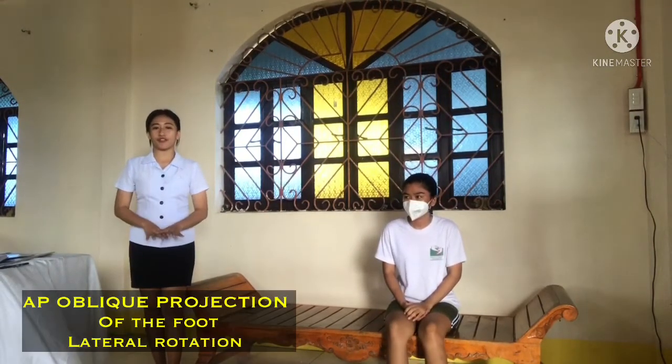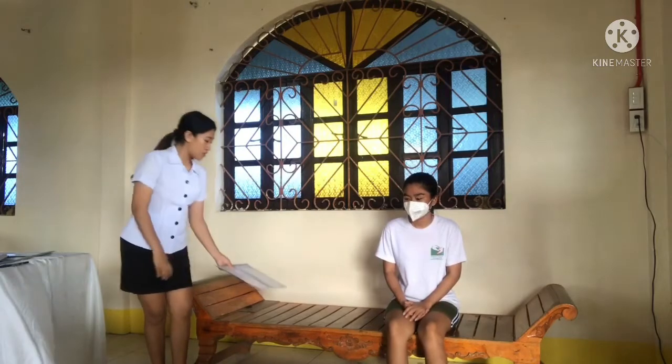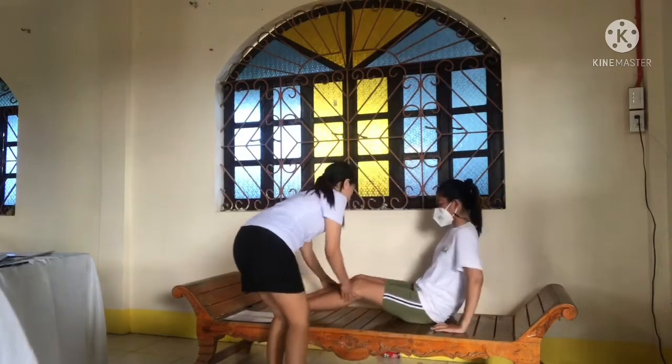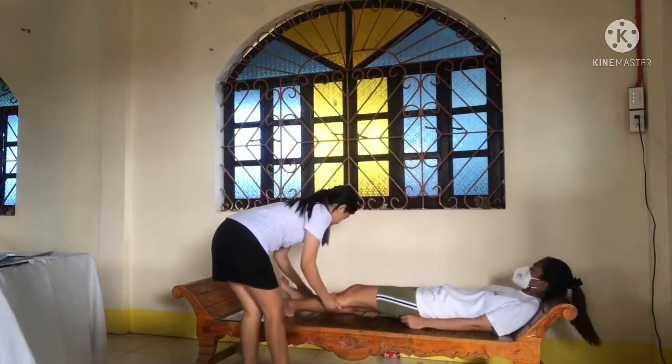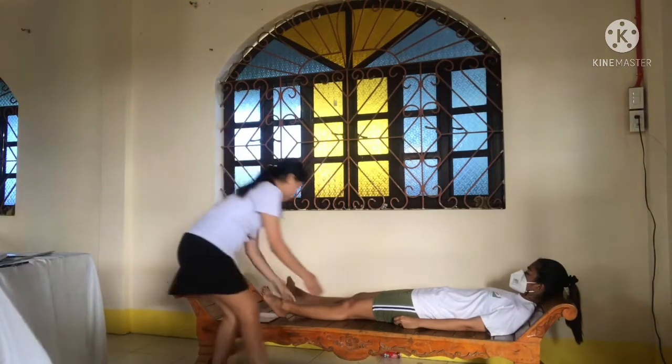So, we proceed to the AP oblique projection of the foot, lateral rotation. So, the IR used must be 24 by 30 cm lengthwise. So, place the patient in supine position. Flex the knee of the affected side enough for the plantar surface of the foot to rest firmly on the radiographic table.